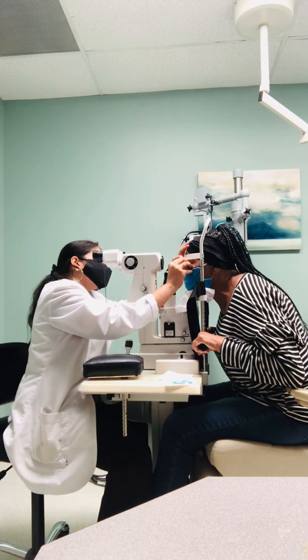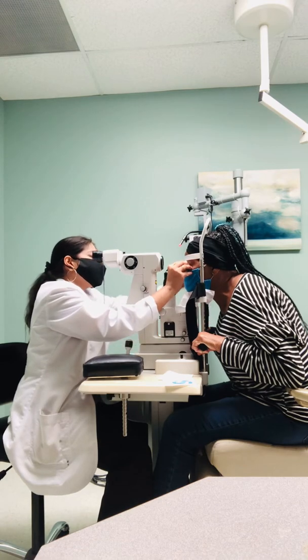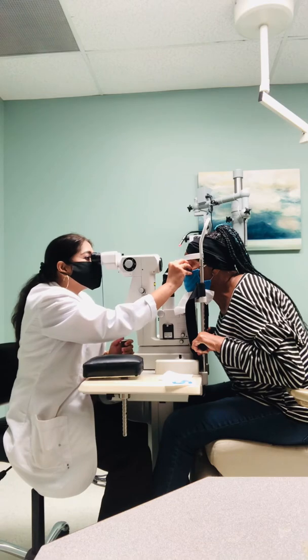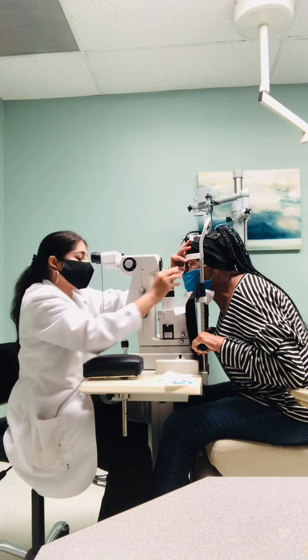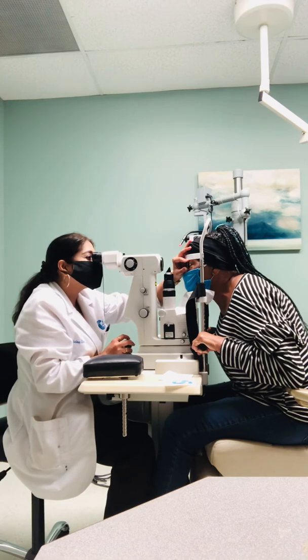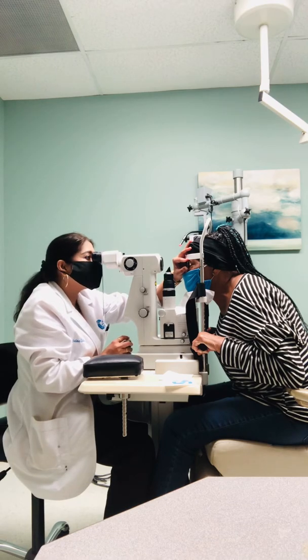I'm just trying to find the best area. Once I align it and look at the area of the iris that I want to target, then I'm going to do that. There we go — I got one shot and it opened up the area.